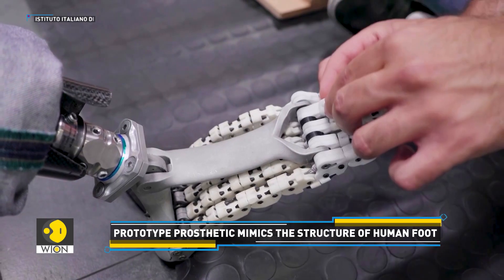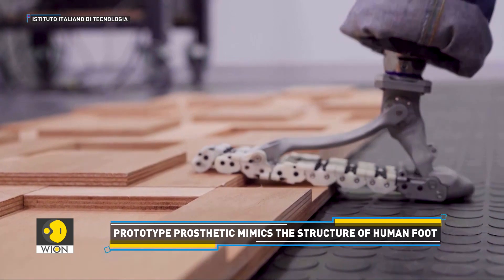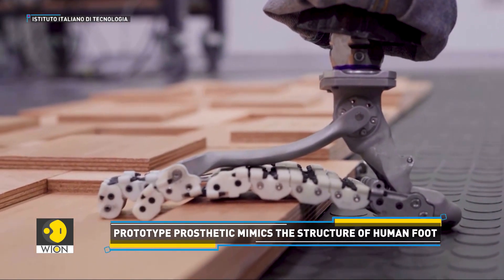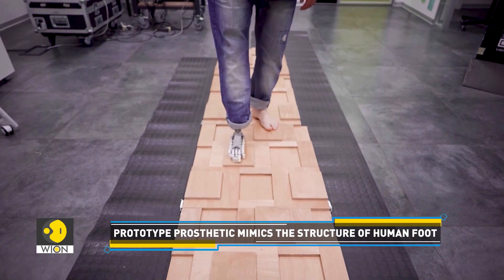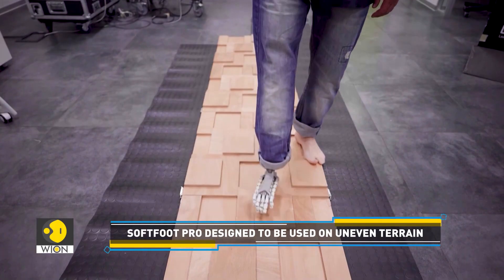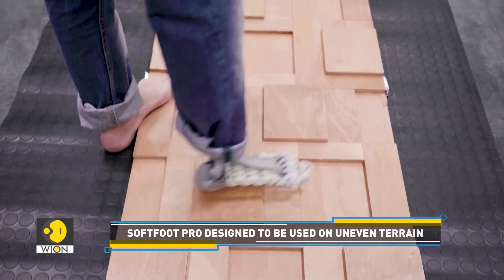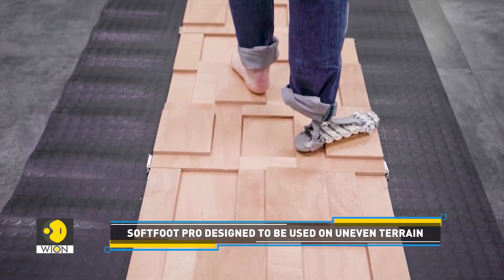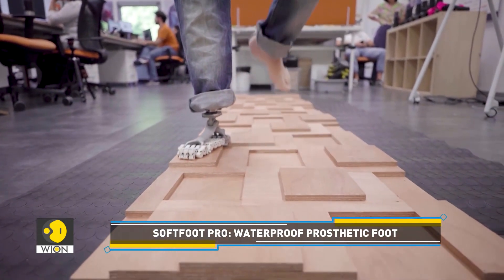But what makes it truly remarkable? The robotic soft foot replicates the flexibility and waterproof characteristics of a human foot. This breakthrough could revolutionize life for those with limb loss. Named the Soft Foot Probe, this bionic foot is engineered for performance on uneven and slippery terrain. It enhances balance for users and may even be used in future humanoid robots.